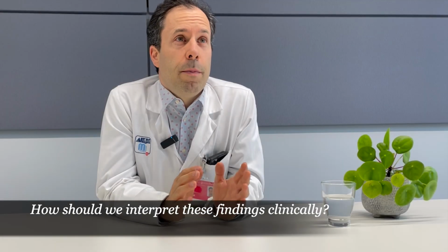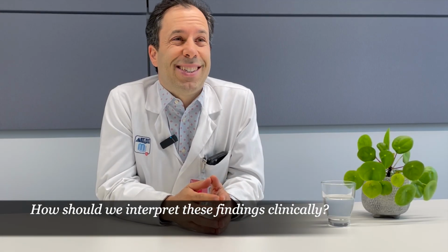Importantly, when we combine the results of the FAPI PET-CT examination with traditional tests like pulmonary function tests, where we measure how the patient's lung functions, or high-resolution computed tomography, which is the standard imaging method to look at changes in the lungs, the prediction became much stronger. For example, models which also included the FAPI uptake improved accuracy markedly, with cutoff values that could distinguish patients who are stable from those who are progressing.